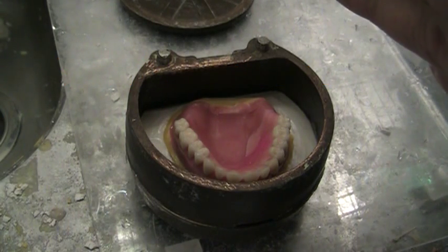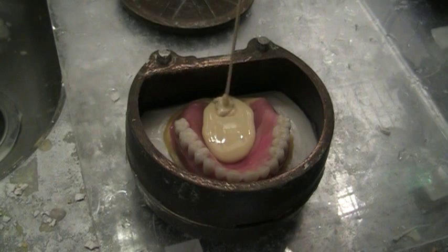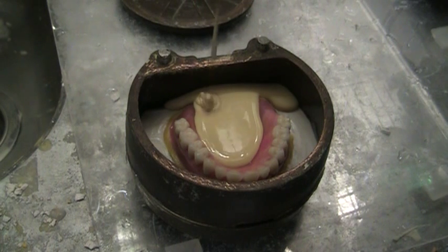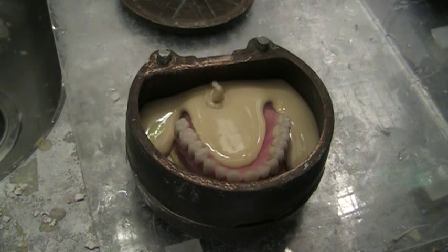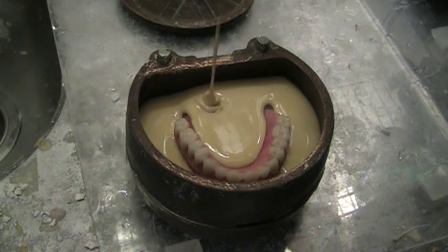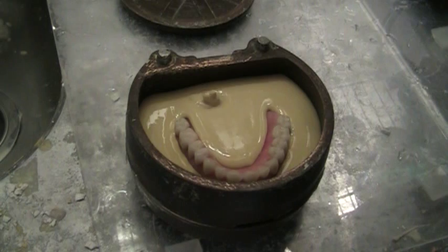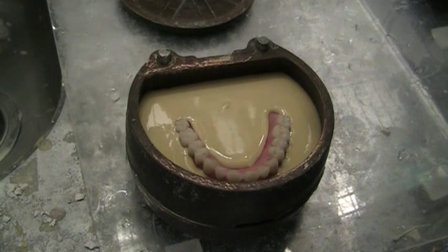I like using this Rapid Flask — it's great. Make sure you hold it far from the bowl and pour it into the flask with a stream rather than try to glob it in. I start in the posterior and let it run forward, let it encircle the landmass, and then work its way up the faces of the teeth. I pour it like this without vibration and never get any bubbles. It flows extremely nice — it's Rapid Flask from Whip Mix. I slow it down just a little to let it catch up because I don't want to over-pour too quickly.